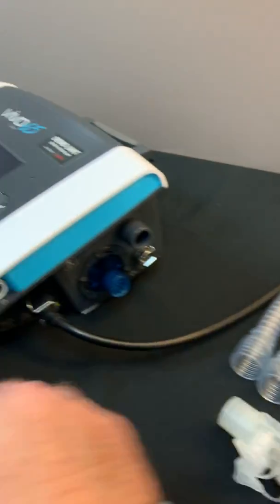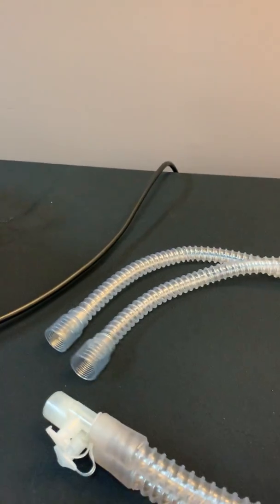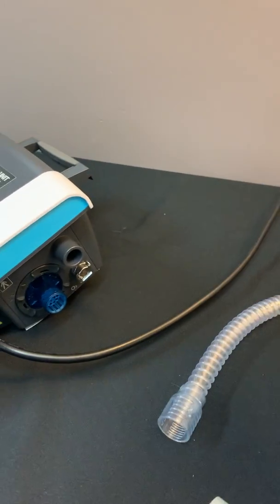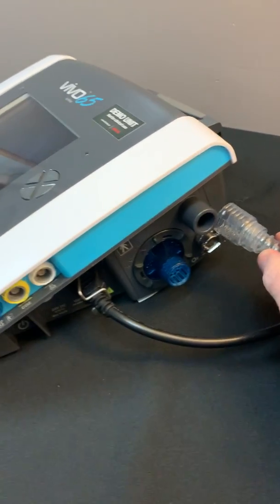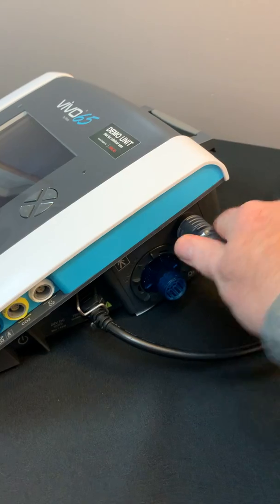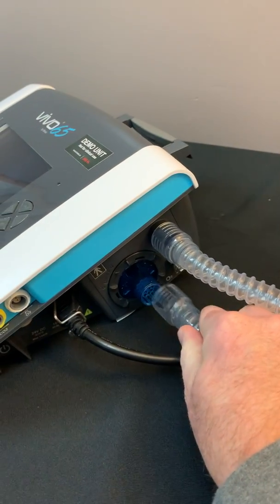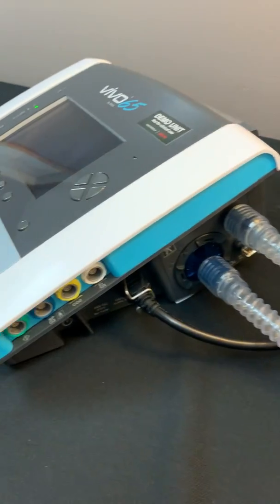As far as the dual limb circuit itself, you can take your inspiratory limb and connect it to the machine. You can then take the expiratory limb and connect that to your exhalation valve.